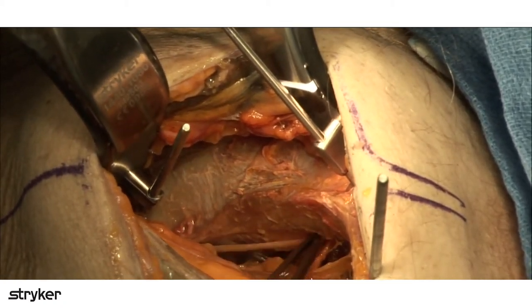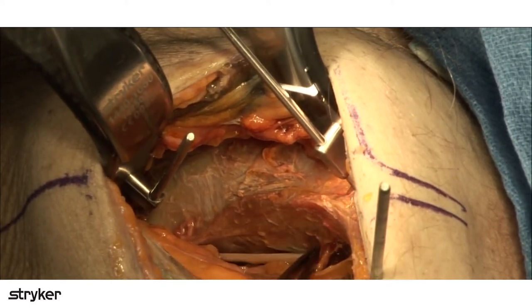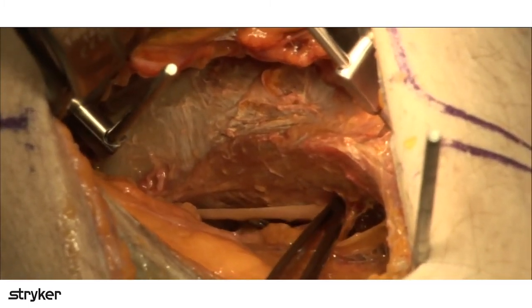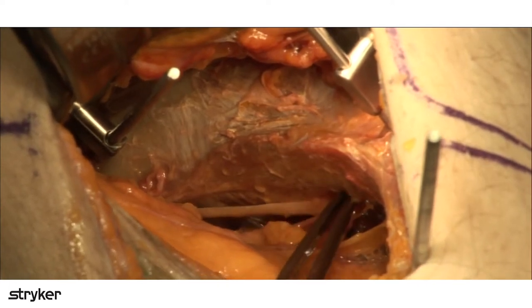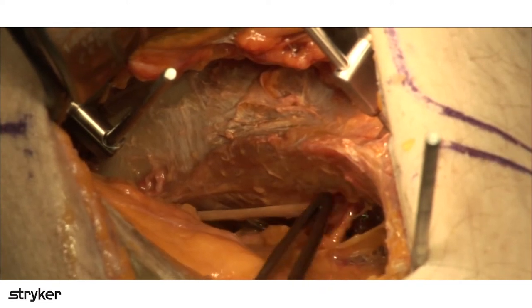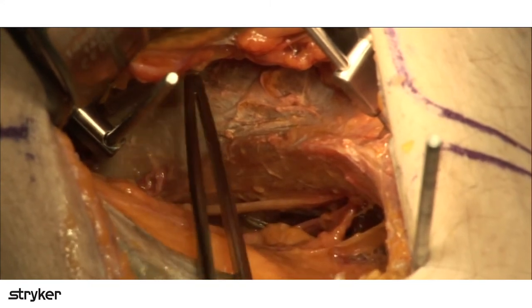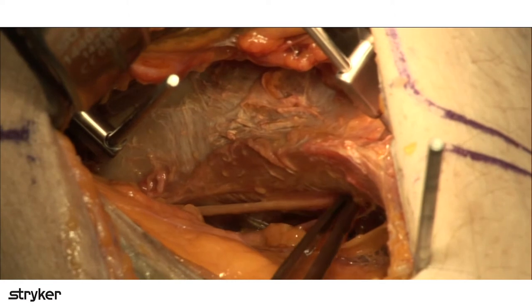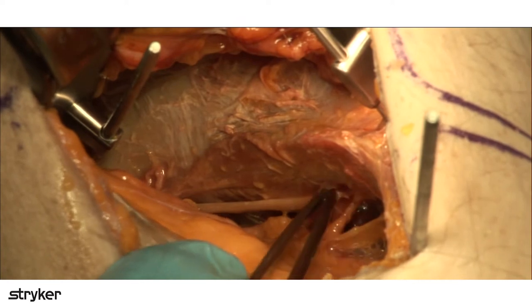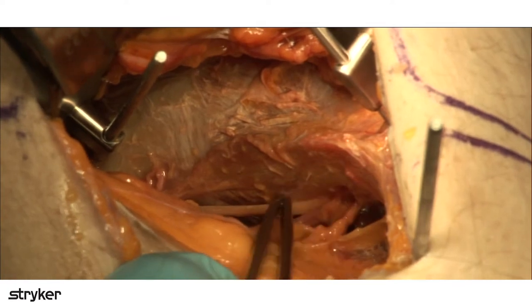The other reason that's a really good idea, I really like doing that, and I thank Mike for enlightening me on this, is that even in elderly people who have not so great bone, when you're trying to reduce the anterior column, this is a great place to put the tine of a retractor. You push the obturator nerve down out of the way, and you come into the top part of the obturator tunnel right here, and you put a clamp right there and another one up here in the pubic eminence, and that reduces the lower part of the anterior column fracture. So even in people who have bone that's not so great, that's still good quality cortex that you won't puncture through, unlike here.